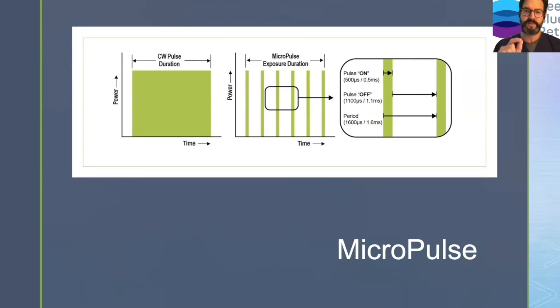And from a biological perspective, this is at least the way that I understand it, and perhaps there are people who understand it better than me, it's about thermal diffusion from the point of laser. Because with the photosensitizing effect on the molecules that are accepting, usually melanin, as the temperature in the spot rises, the longer duration will increase the thermal diffusion around it and will cause apoptosis of cells around it. So it is a reasonable physical concept to decrease the amount of thermal duration of energy.